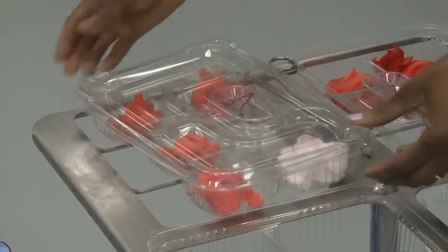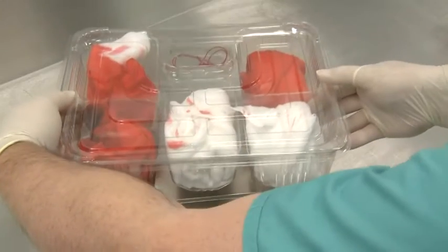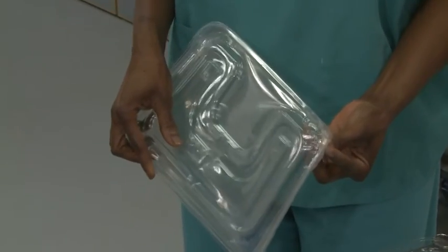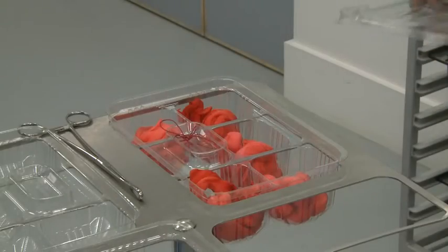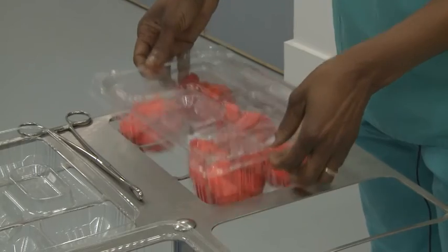After the scrub practitioner and circulator have counted together and agreed, then the lid can be secured correctly. The lid, when applied securely to a full container, traps airborne bacteria and eliminates evaporation, so weighing is more accurate. Ensure you have one lid only, which is the correct size for the container. Line up the raised area of the lid, which has Swabsafe embossed on it, with the swab red tie compartment and fit securely.